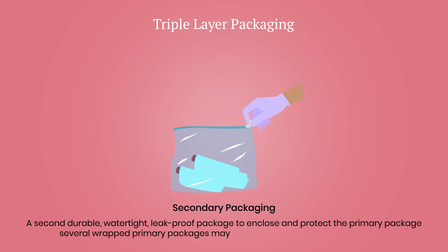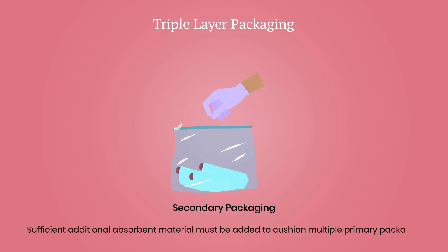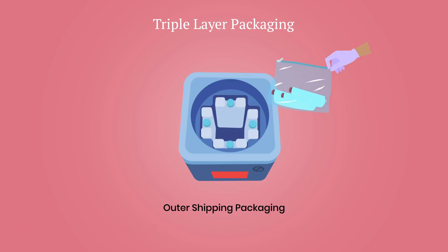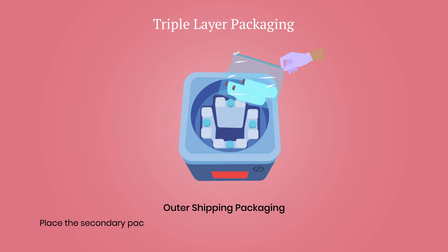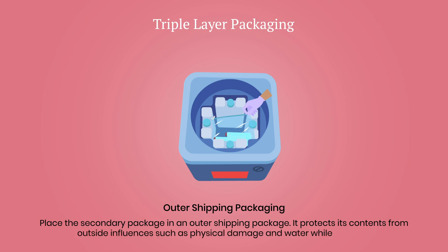Several wrapped primary packages may be placed in one secondary package. Sufficient additional absorbent material must be added to cushion multiple primary packages. Outer shipping package: the secondary package is placed in an outer shipping package — that is, a shipment carrier — with ice packs, which protects it and its contents from outside influences such as physical damage and water while in transit.